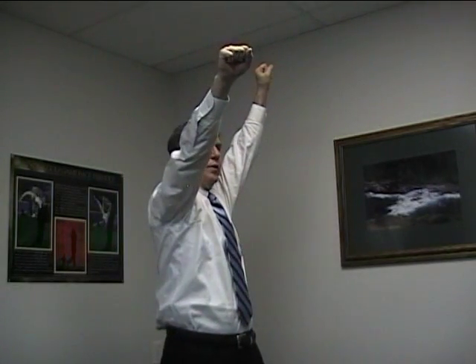The tendency of the patients is going to be to do it this way by rotating the shoulders. And we don't want them to rotate their shoulders. We want their body to stay neutral. So when we're facing the door, we're always doing strengthening. So as I pull down with the right arm, my left arm is going to be resisting. As I pull down with this one, it will be resisting.